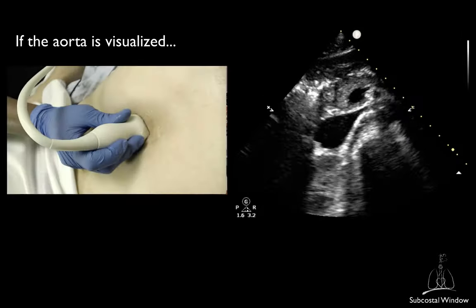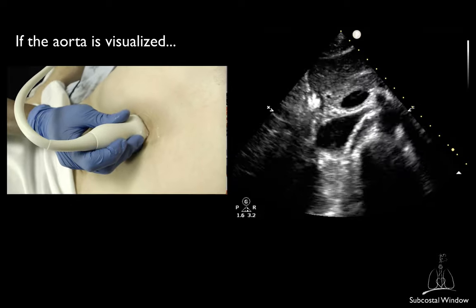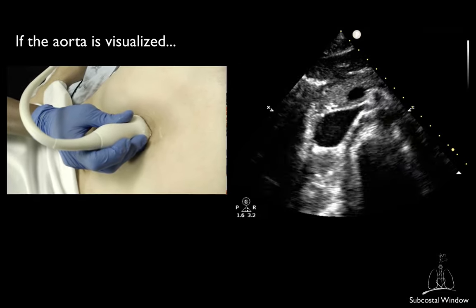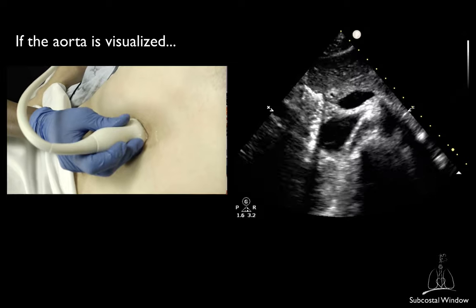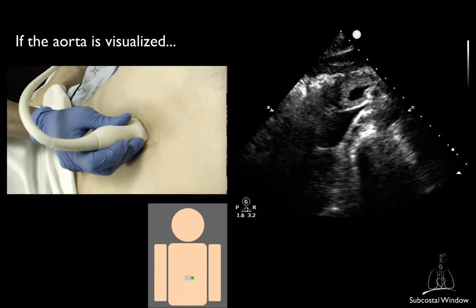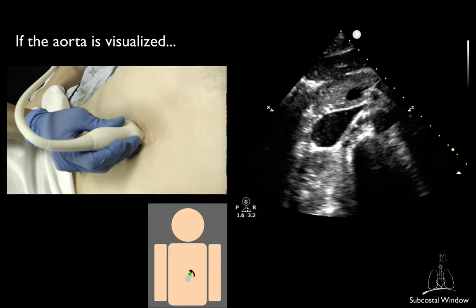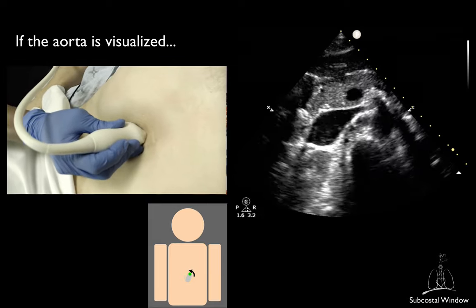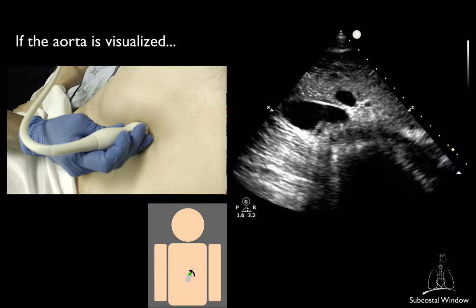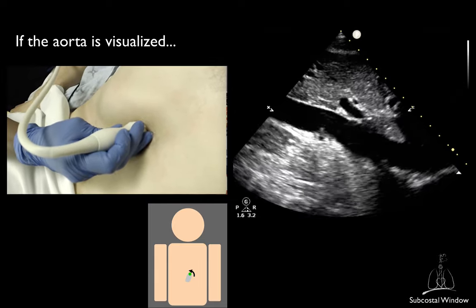You can also obtain the IVC view starting from the short axis of the IVC by placing the probe directly flat on the patient's abdomen, with the marker directed to the left at 3 o'clock. You can then rotate on the axis of the IVC counterclockwise to obtain the long axis of the IVC, with the marker ultimately positioned upwards.